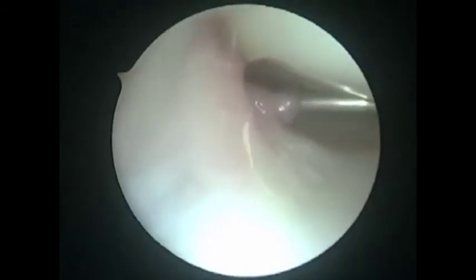Next, the dorsal ganglion cyst stalk is located with use of a 22-gauge finder needle. The stalk is most commonly emanating from the scapholunate ligament at the 3-4 interval. Placement of the finder needle results in decompression of the cyst as it passes through the cyst wall.